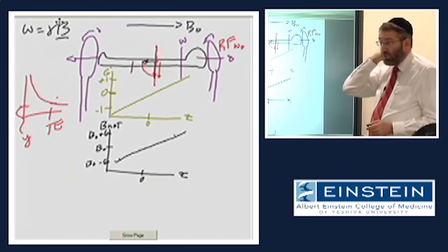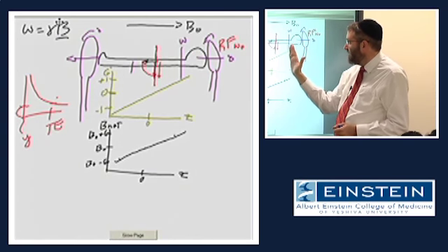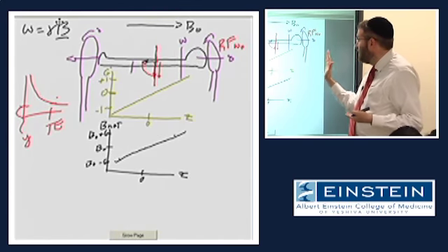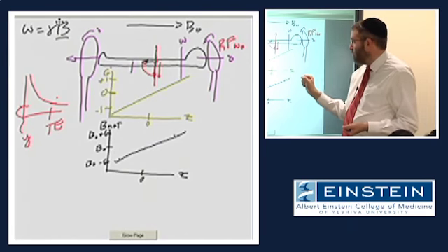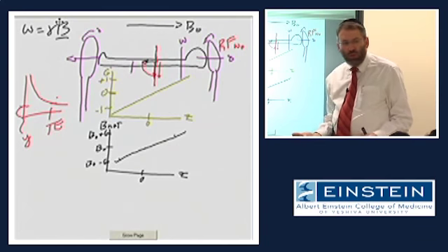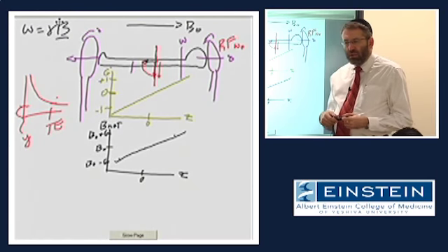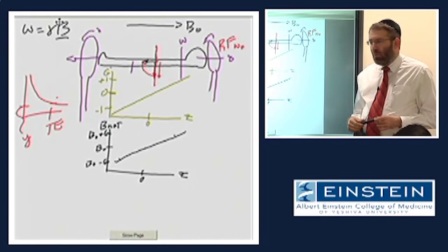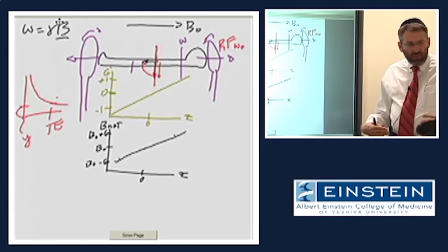Now, in this example, using this gradient magnetic field, we're able to select an axial or a transverse slice, something perpendicular to the long axis of the body, anywhere along this head-to-foot dimension. As many of you know, one of the great things about MR as opposed to CT is that we have the ability to image the patient in many different planes. So we're not limited to looking at the patient in the axial plane. Well, what if I was interested in looking at, let's say, the liver, and I wanted to do coronal imaging of the liver?